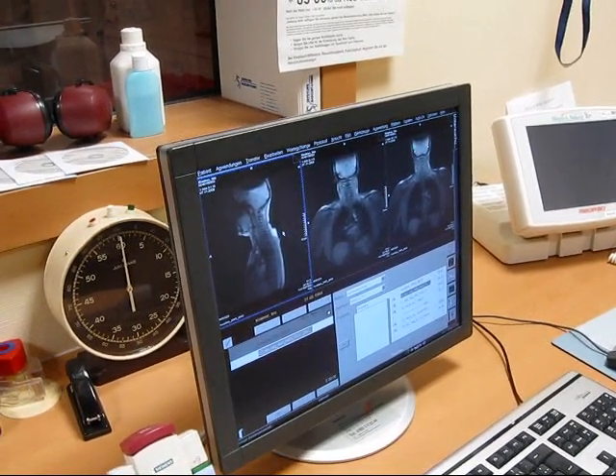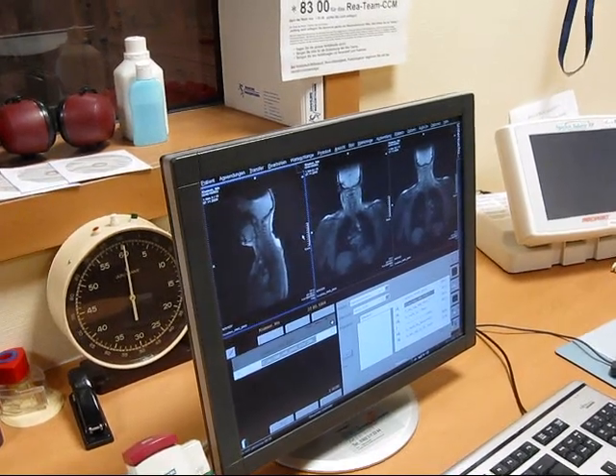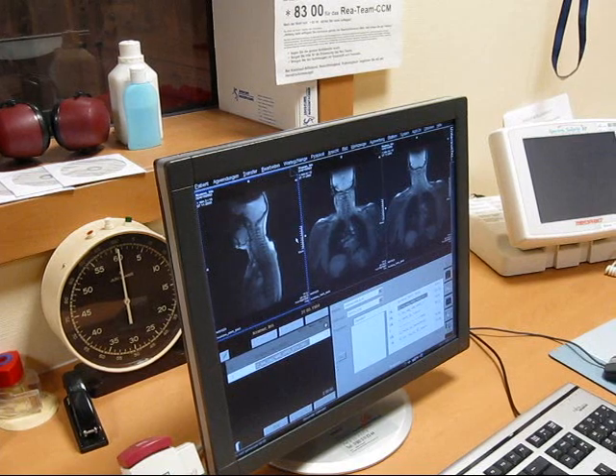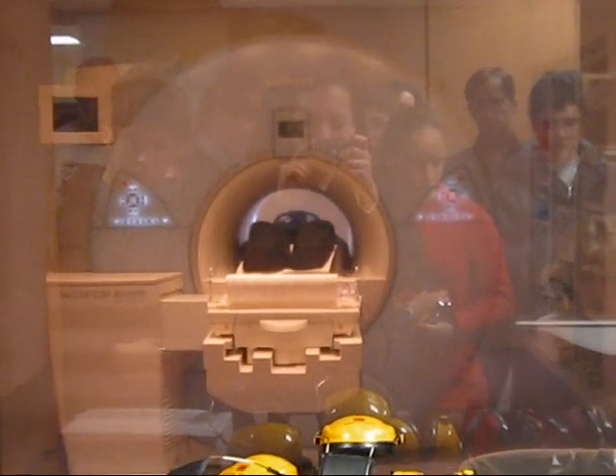She is now explaining the antenna coil and how it works. The coil basically absorbs the radiation that is scattered back from the body and thus produces images with it.